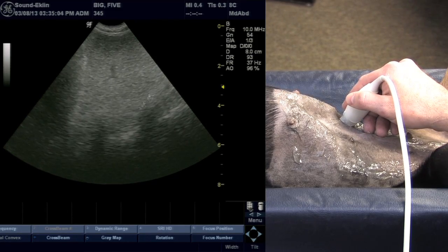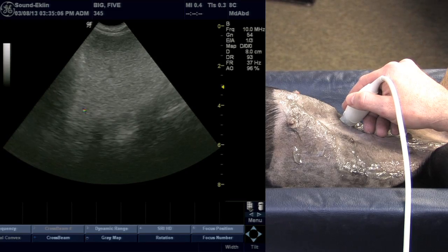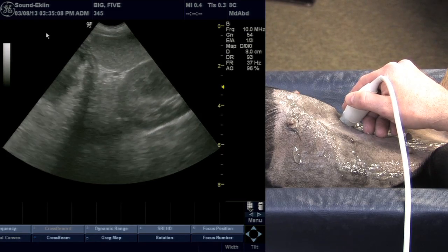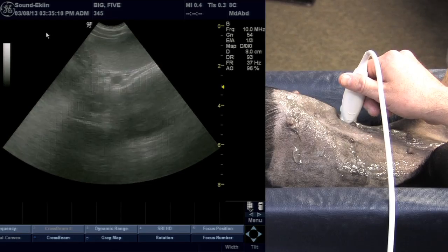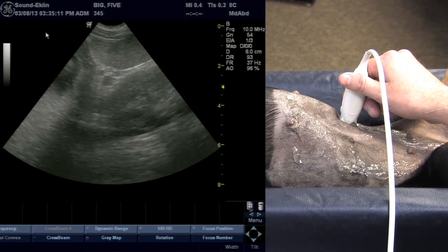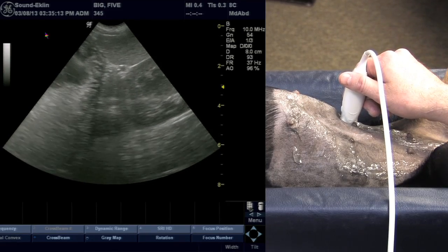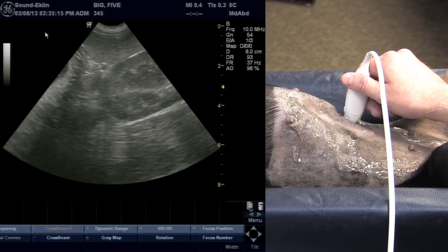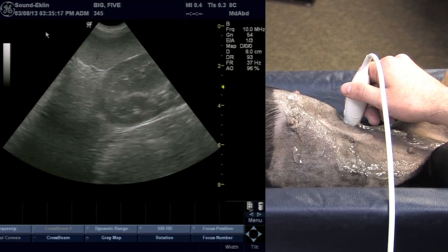Some people refer to that as a shark's tooth because of its triangular appearance. Then we will straighten the probe back up until we're perpendicular to the patient, and at that point we're going to scan the tail and body of the spleen.